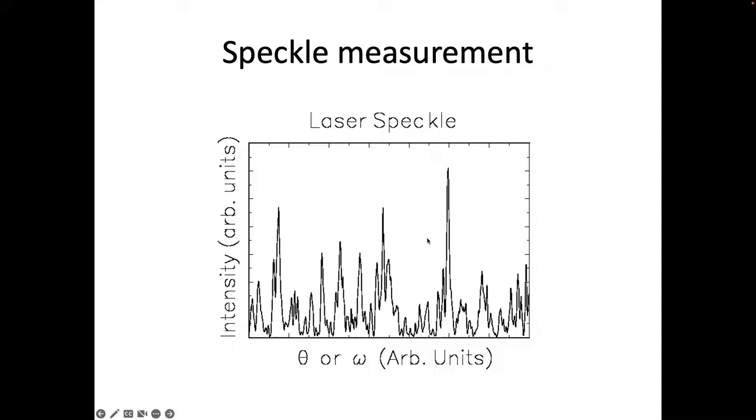But this one, E1 with E1 star, you cancel the phase because it's the complex conjugate. So this is just an intensity. This one is an intensity with an e to the i delta phi, that is the phase difference between 1 and 2. And this one is an intensity. This is intensity 1, 3, e to the i delta phi 1, 3, and so on.